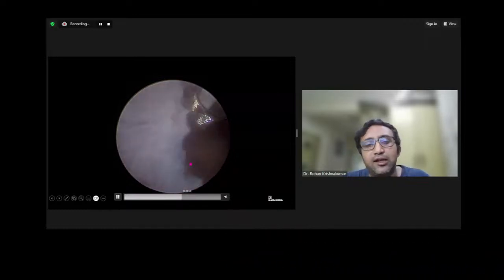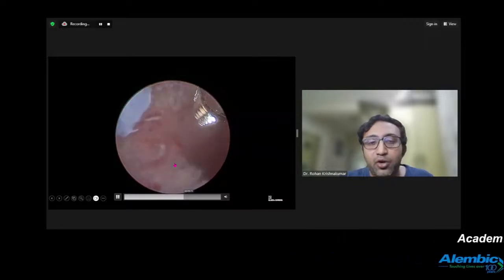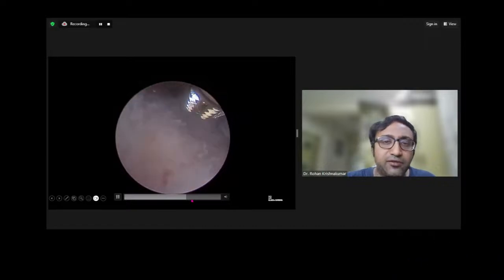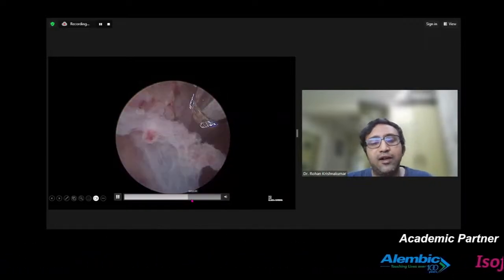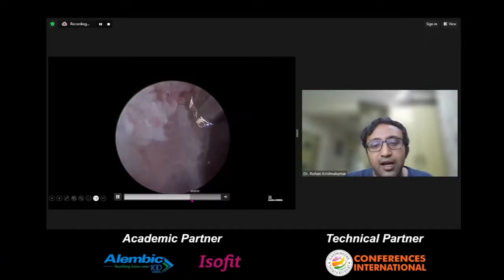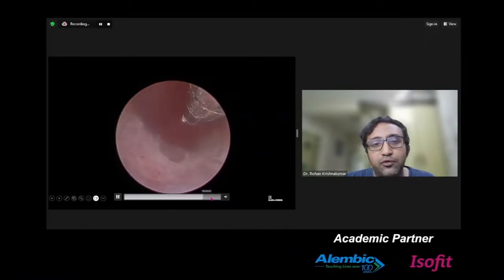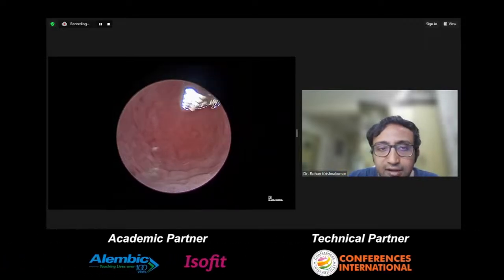So we are doing this routinely now for many of the RPOCs, even some difficult embryo transfers where we can't negotiate. We are using this HTRS to actually, if there's cervical stenosis, correct it with this instead of going in with the dilator. So you can see we have not touched anywhere else in the endometrium, just dealt with the difficult part. And in the second sitting, planned a hysteroscopic septal resection. So that's how technology is useful in preventing more and more complications and in solving it ourselves better.